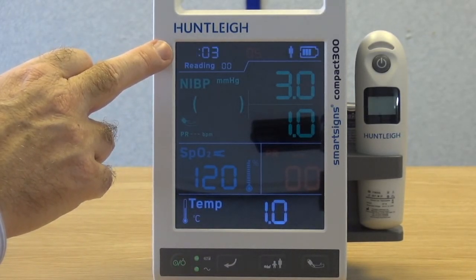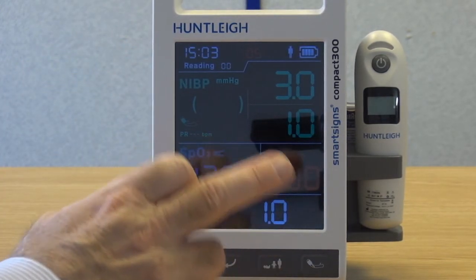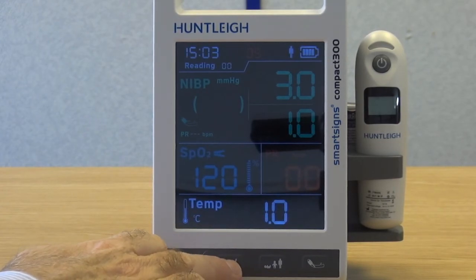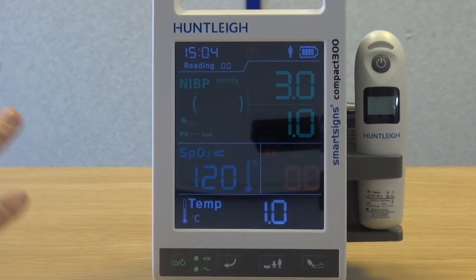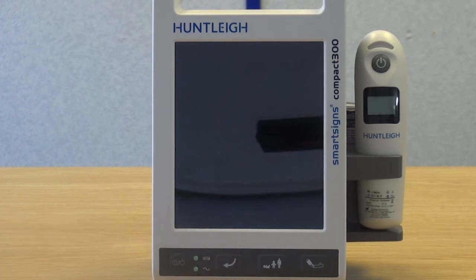The next setting is the time. Use the patient group selection and start-stop button to set the correct hours, then press the enter key to advance. Repeat this process for the minute setting. Switch the system off to save settings.